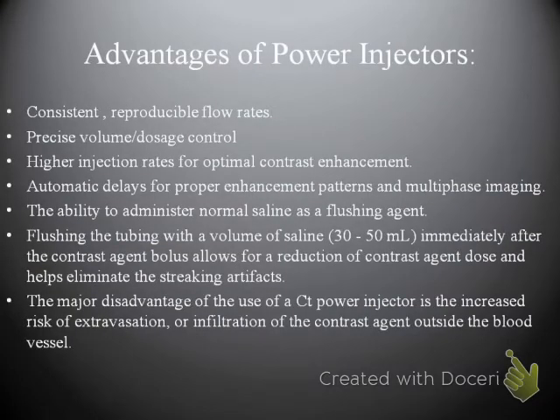So that brings us to the advantages of the power injectors. We see that they have consistent, reproducible flow rates. They deliver precise volume, and they have dosage control. They have higher injection rates for optimal contrast enhancement, because they can push faster than we typically can. Automatic delays for proper enhancement patterns and multi-phase imaging, so they take all the guesswork out and make everything adequate and accurate.